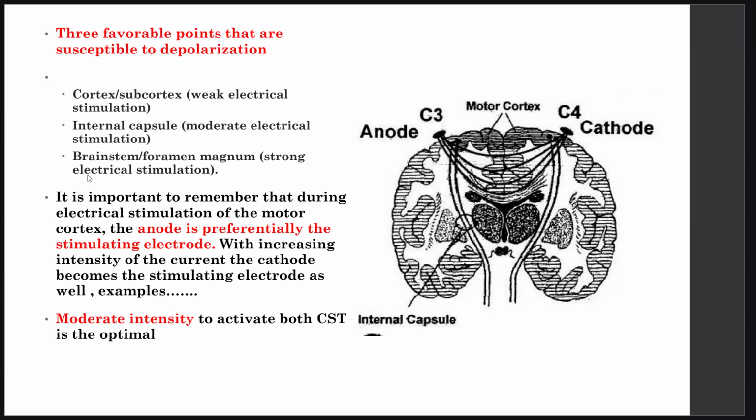So when you have a lesion above the brainstem, you don't depend on motor evoked potential alone. Why? Because I have a site of stimulation that can give me a motor response in the brainstem, and also I have it in the corona radiata, and I cannot know which is which. But the intensity of the stimulation suggests the site. More intensity is deeper. But it only suggests, so we should take care of this.